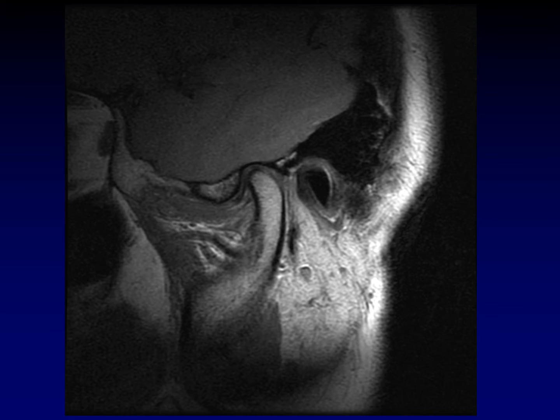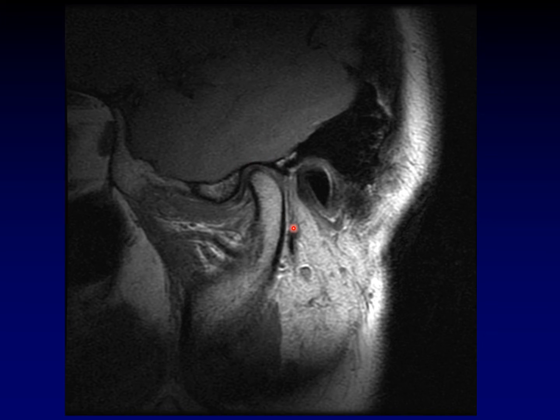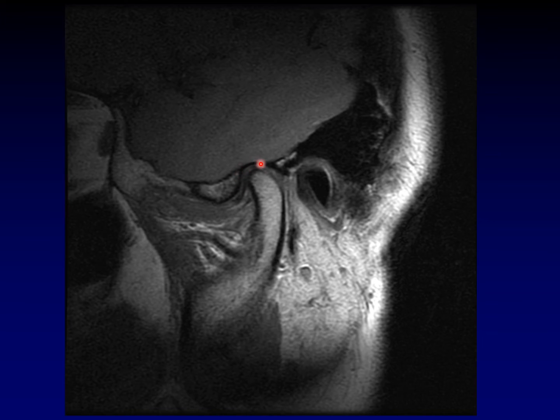On the sagittal oblique T1 weighted image, the condylar head, condylar neck, and ramus are visible in the center of the joint. The socket is called the glenoid fossa, and anterior to it is the articular eminence. Behind it is the external auditory canal, with the temporal lobe above. The interarticular disk appears as a dark object between the articular eminence and the condyle. Note how smooth and round the condylar head is, with the glenoid fossa serving as a smooth, rounded receptacle.